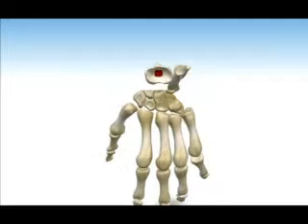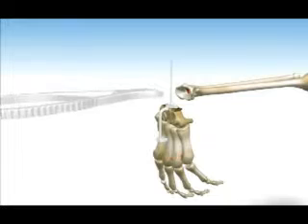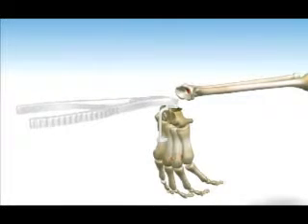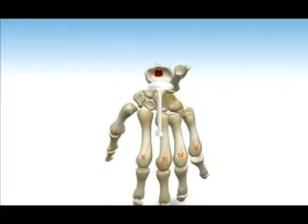Step 4. Position the PGT carpal template over the capitate and third metacarpal. Drill the K-wire to the depth of the carpal post length of the implant size that was preoperatively assessed. If trial reduction is desired using the carpal template, then cut the wire and place the carpal ball trial over the carpal template. If desired, the carpal template can be used to prepare the pilot holes for the screws.